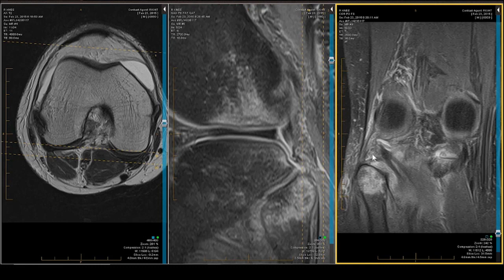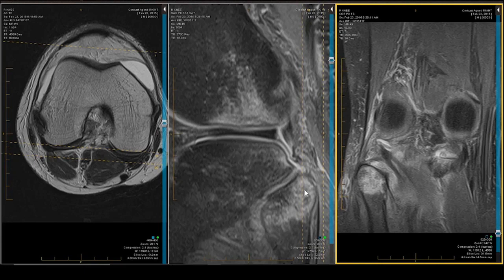In summary: ACL transection, multiple micro- and macrotrabecular bone injuries including real fractures of the lateral femur and fibular head, arcuate complex tear, popliteofibular ligament tear, mild posteromedial corner injury, and sparing of the PCL. These key points belong in the conclusion. Minor findings such as soft tissue swelling go in the body, and the only pertinent negative worth including in the conclusion is that the menisci were spared.